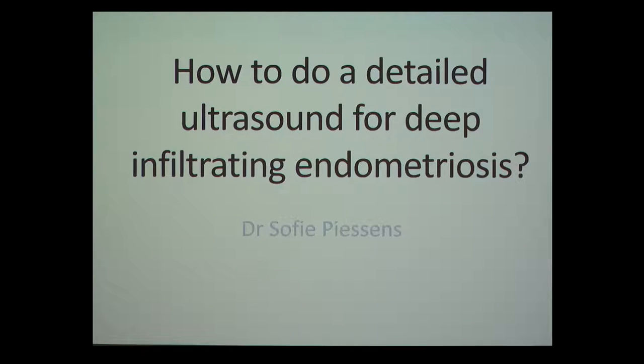This talk is going to go through how you can do an ultrasound and find endometriosis. It goes from organ to organ looking at different things, showing a normal clip and an abnormal clip so you can get an understanding of what we can see with ultrasound.